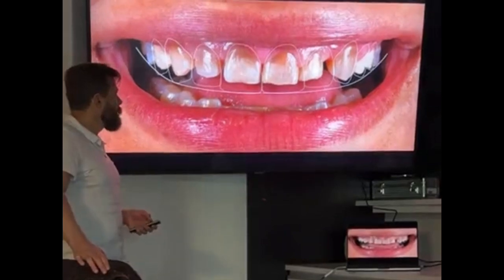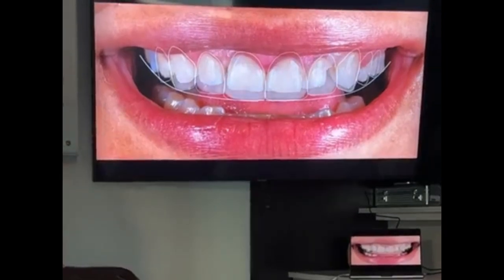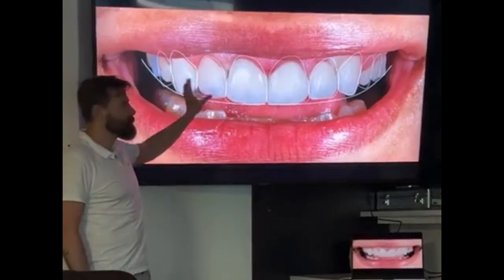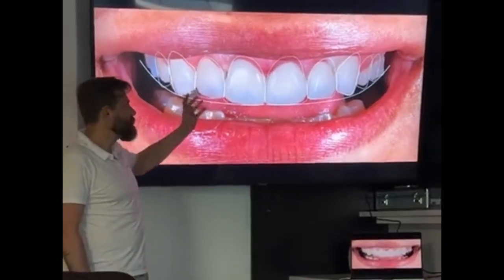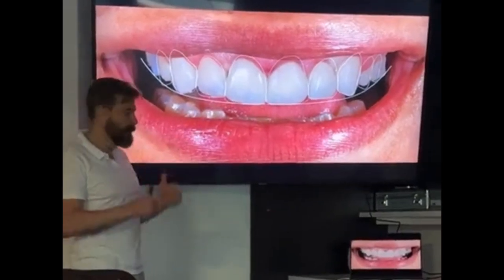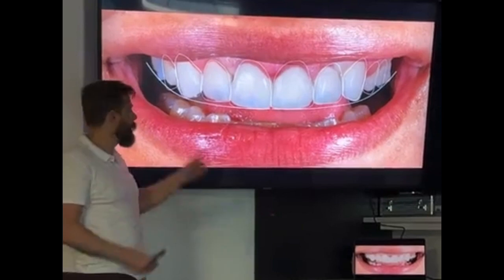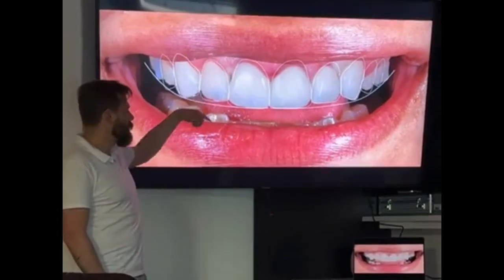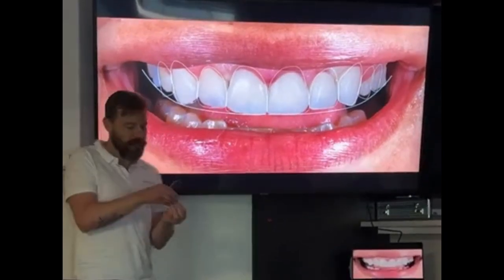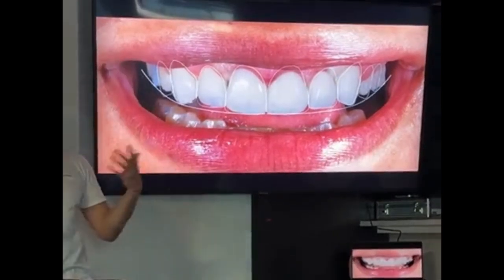Nice. So we start the day, or the morning, with this arrangement, and you finish the morning with the new provisional over the implant. All the implants were between 50 to 60 newtons of torque, a good implant. If you have any doubt about the primary stability here, you can just connect to the neighbors, increasing the stability. This is not a patient that has any bruxism, but even so we take an impression after that, and 3-4 days later we have a night guard. Why is that? The problem is not the centric position. The problem is lateral and anterior movement, especially when the patient is sleeping.